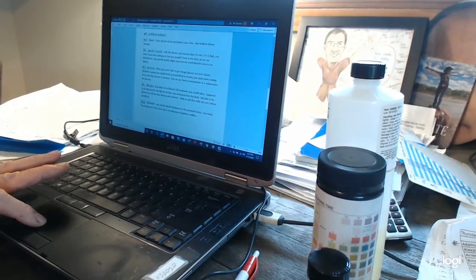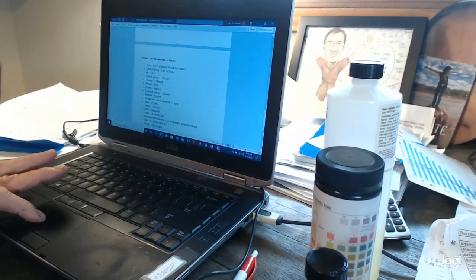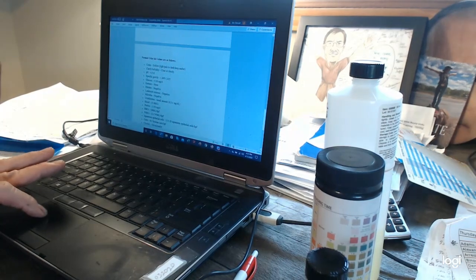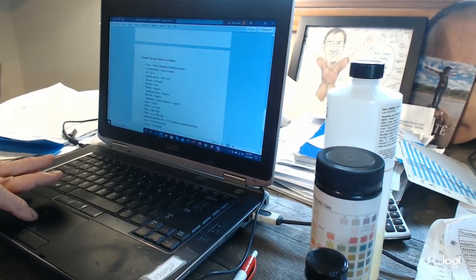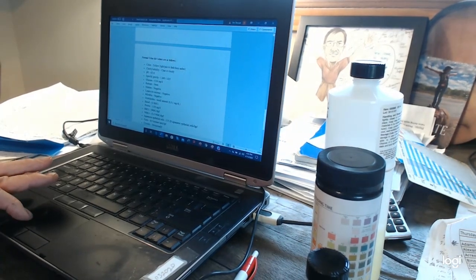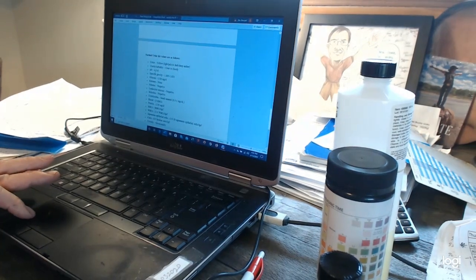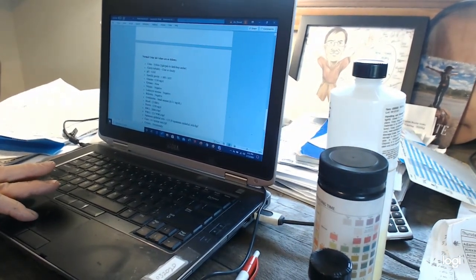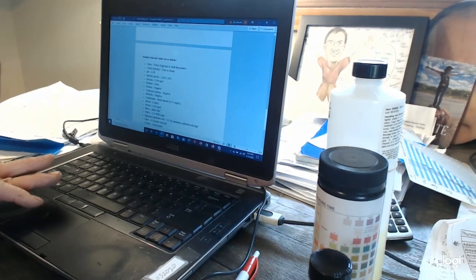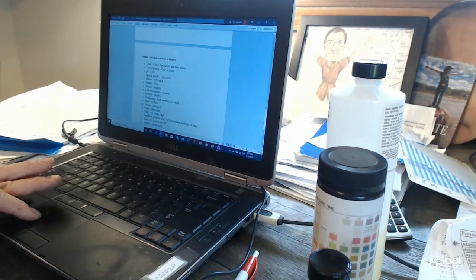So we're going to look at a few samples and see if they have any of these things. Here's some normal lab values at the end of that sheet too. It says about what they should be. Here it says pH 4.5 to 8. Again, 4.5 is really low and 8 is really high. That's not exactly normal, but it can be that low or high based on diet and things like that. It doesn't necessarily mean you have kidney disease, but somewhere between 6 and 7 is more common.